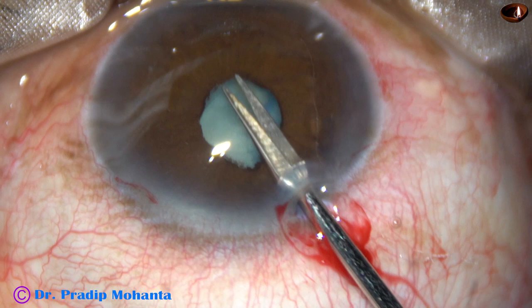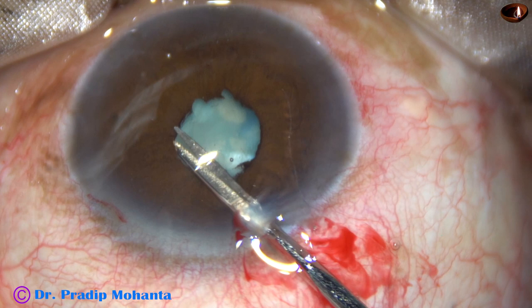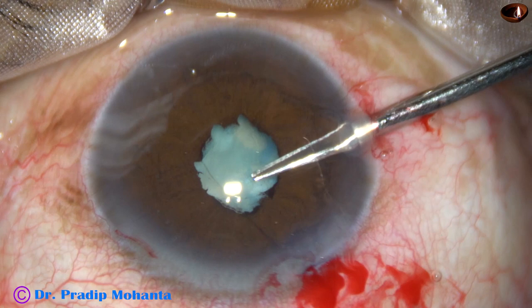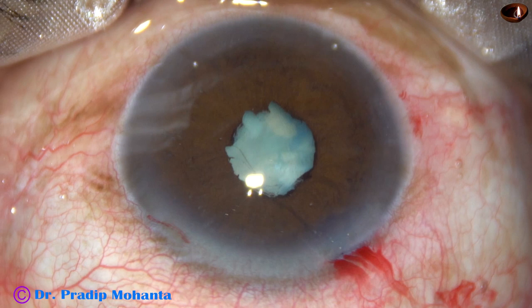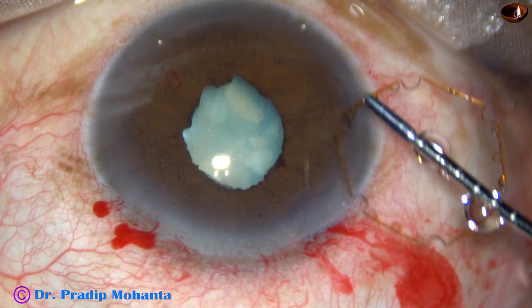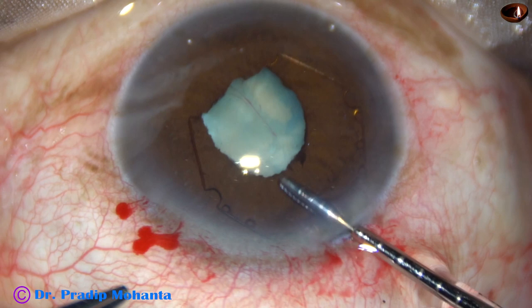The fibrous band is cut at 3 places. Now I go through the right side port. The side port is small and I am finding it difficult to maneuver, but I could manage. Now I am going to incise the fibrous band here. The B-Hex pupil expansion device is being used with the help of B-Hex forceps. The device is taken completely into the anterior chamber and the leading flange is tucked, then the flange at 1 o'clock is tucked.